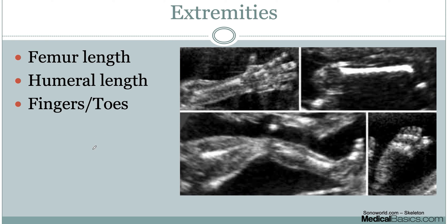Next is the extremities. This is important for sizing — you'll base size percentile on both the femoral diaphyseal length and the humeral diaphyseal length, along with brain and calvarium measurements. Also make sure there are five fingers and five toes. This matters beyond the obvious reason: polydactyly is associated with many other conditions that key you in to look more closely at specific related organs.